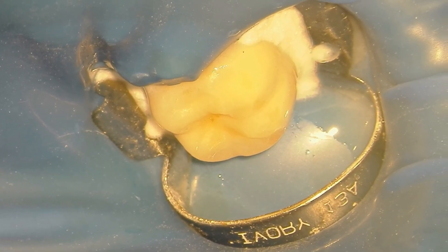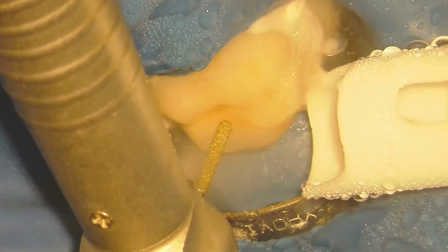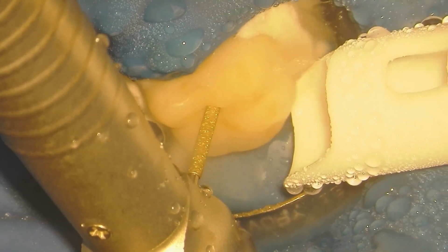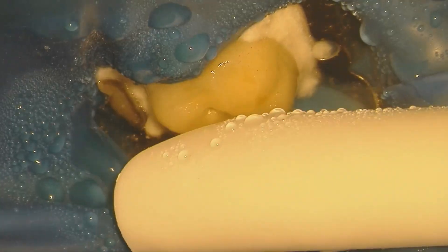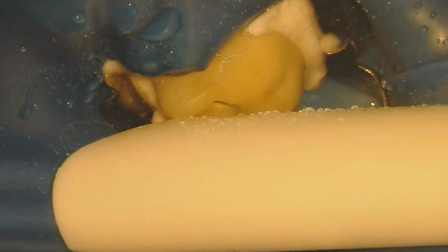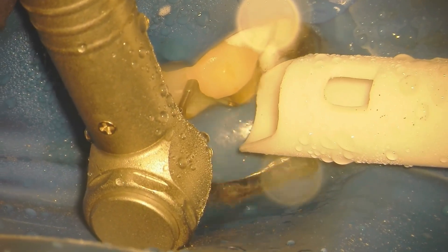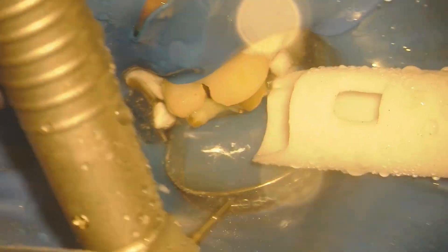We've used a 13A clamp. We're going to place a small access and we're going to discover that there's gross caries. Once we discover those gross caries, I'm going to begin sectioning that crown on the tooth. While I am sectioning that with a carbide burr, I'm going to tear the dam. Once I tear that dam, you're going to see it up in the upper portion of the frame. I cannot use that dam anymore, so I'm going to remove it and place a new one.